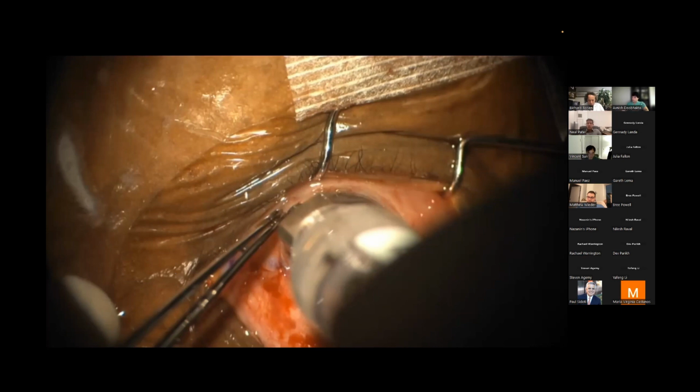So definitely we would do it next step, 100%. The other thing that I'll point out, and this is something that sometimes when I'm with fellows, I'll get into not an argument, but we'll suddenly discuss that the existence of air in the AC does not necessarily mean you have to make a PI. I didn't see you guys did, right, Neal? You didn't make a PI. No, we didn't. And just because there was air there did not mean that you have a unicameral eye.